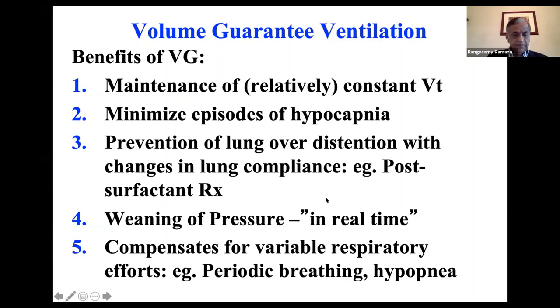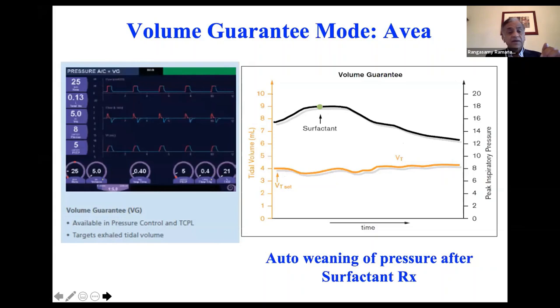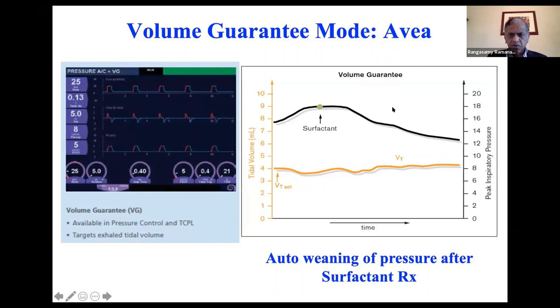Here on the Viasys ventilator: tidal volume is set at 4 mL/kg. Before surfactant, the ventilator was using about 18 centimeters PIP. Once surfactant is given and lung compliance improves, the ventilator automatically decreased PIP to 13 centimeters to deliver the same tidal volume of about 4 mL/kg. This demonstrates how volume guarantee mode works — you can set it up in either pressure control plus VG, or assist control plus VG mode.